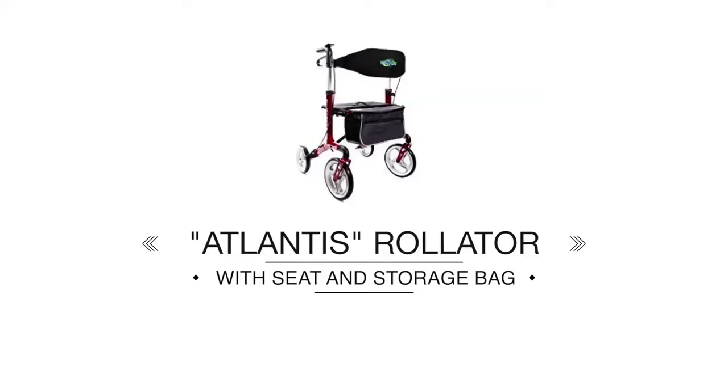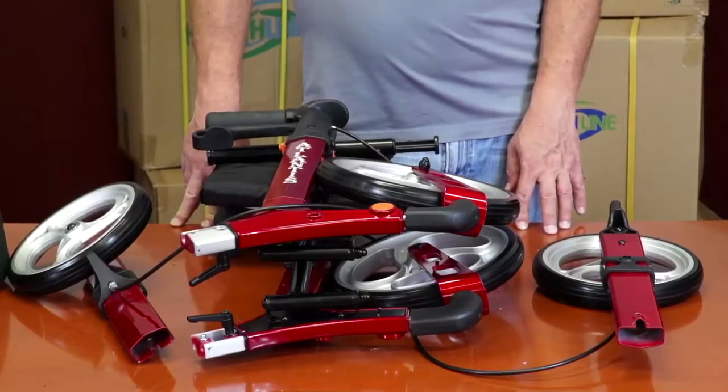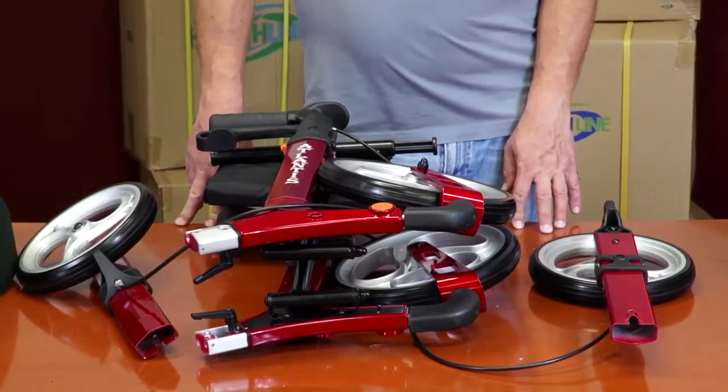The Atlantis Rollator arrives in a semi-assembled state. The kit consists of six distinct parts.